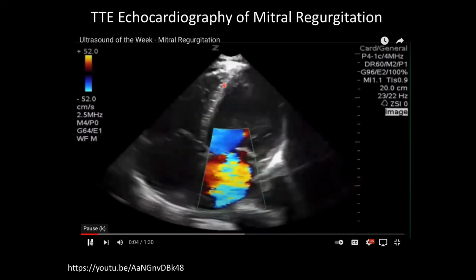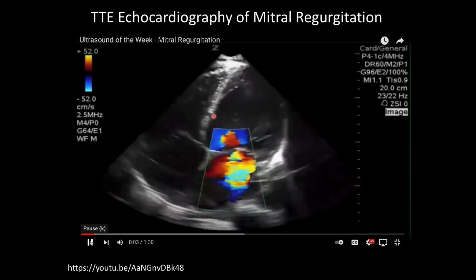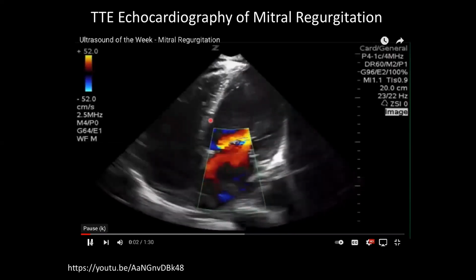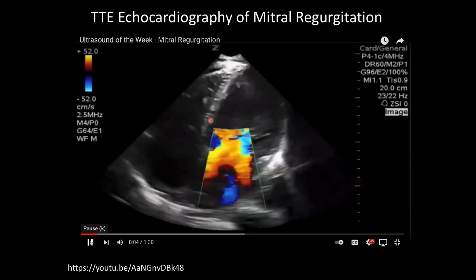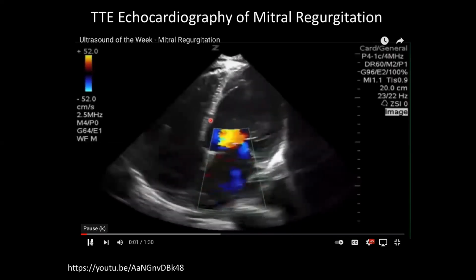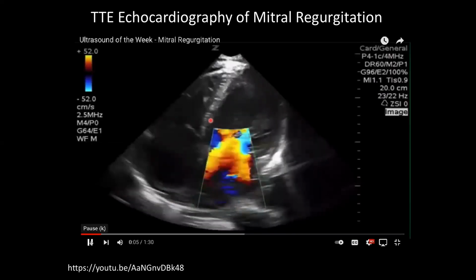There isn't a lot of contraction occurring in the septum itself. You don't see all of these features. This speckle doesn't seem to be coming closer together, right? It just seems to be moving in and out like it's a stiff object that is just translating. It's not straining, right? It's not shortening.